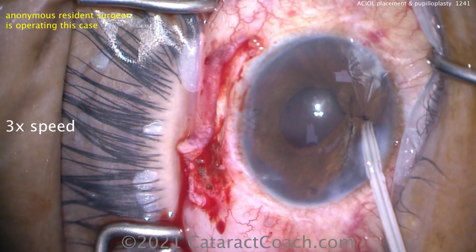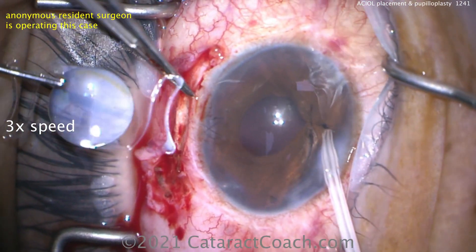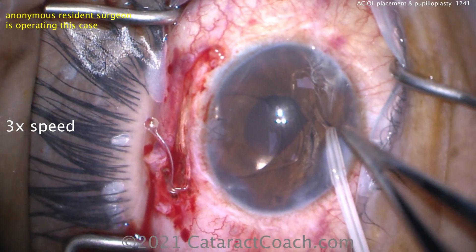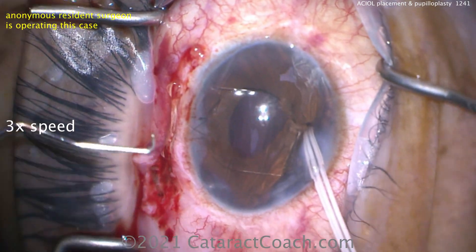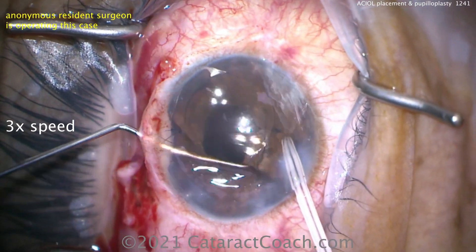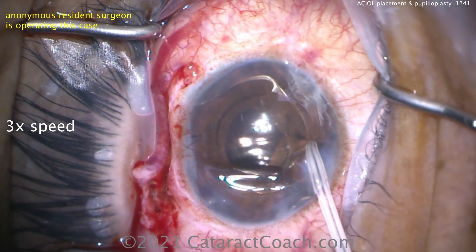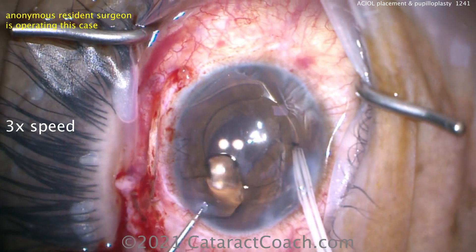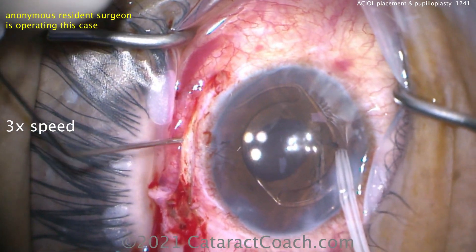This patient is on the young side — look at those eyelashes, not a single gray hair. He has a very strong endothelial cell count — about 3,000 cells per square millimeter — so this will be just fine with an AC lens. Here comes the AC lens. Now, is the orientation correct or is it upside down? Look at the haptic-optic junction — it should be the same as any other lens: check where the haptic touches the optic. Why is the AC maintainer not on? Turn that on — deepen up the eye, it makes life so much easier. Don't do this under a flat eye. This is a unicameral eye. There was an inferior PI made at retina surgery, and there are gaps in the iris tissue from suturing, so there's no need to make another PI — there's plenty of flow to avoid pupillary block.